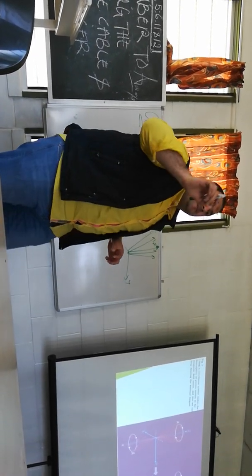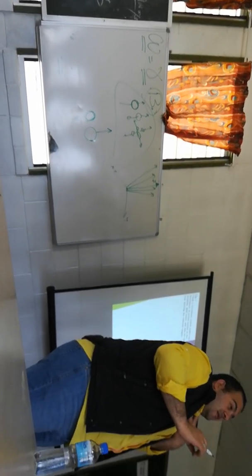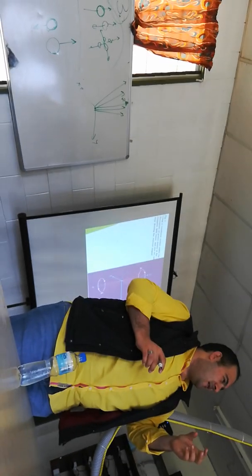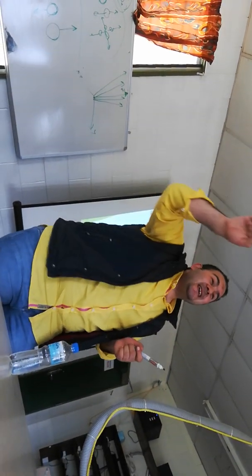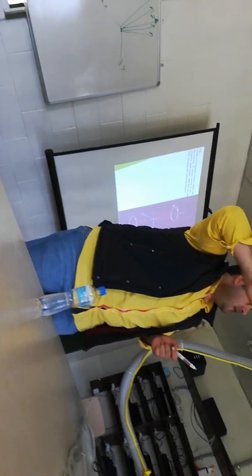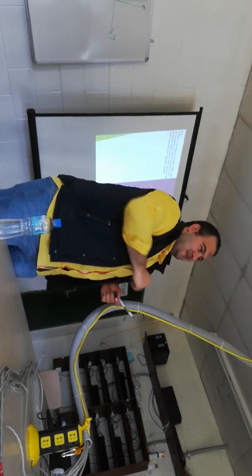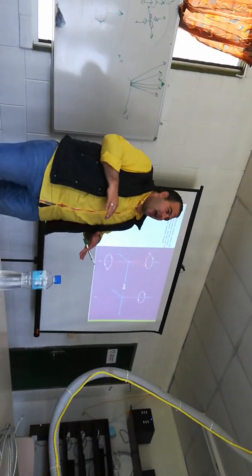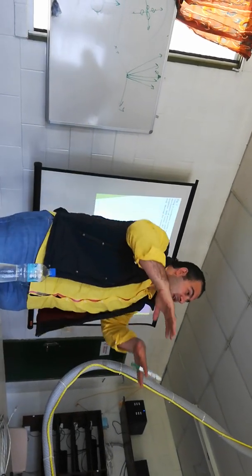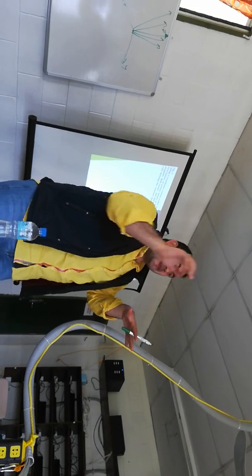These radio waves have a frequency. Why is MRI called magnetic resonance imaging? Resonance. Why? Because the frequency of the incident radio waves has to be the same as the precession frequency of protons. Like, if we are in a race and 2 cars are moving very fast with the same speed, the energy can be transferred from one car to another.